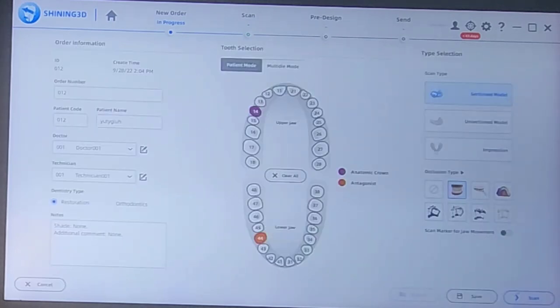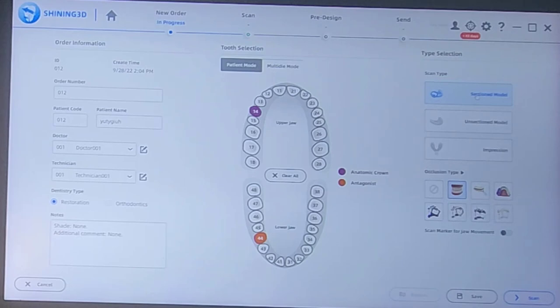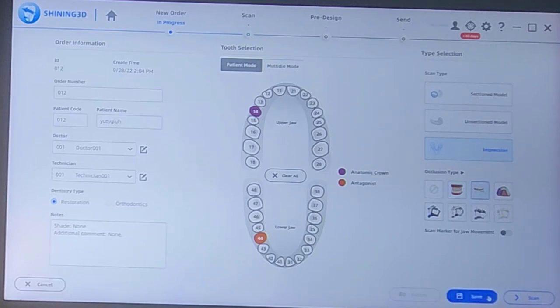You just have to indicate something so that it knows it's scanning that arch. But furthermore, you're going to have to do something in the opposing arch. Once again, you could say Anatomic Crown. I usually will just say Antagonist. And then we'll click Finish. That way the software knows that it's scanning an upper and a lower. If you don't do that, you would only get the one arch.